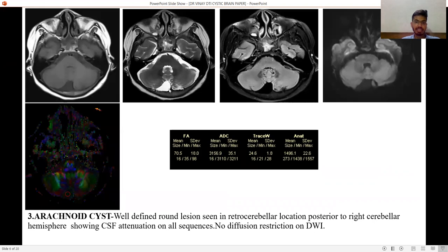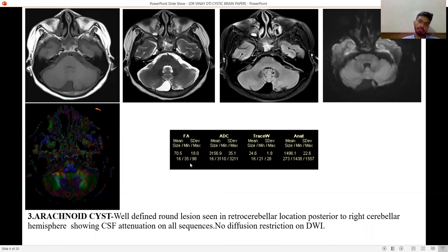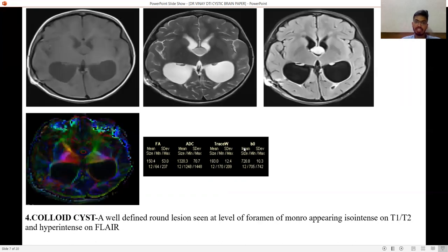Third is arachnoid cyst — a well-defined extra-axial round lesion seen in the retrocerebellar location, posterior to the right cerebellar hemisphere, showing CSF attenuation on all sequences. No diffusion restriction is seen on DWI. ADC value is highest here because it is of CSF density, so movement of water molecules is unrestricted.